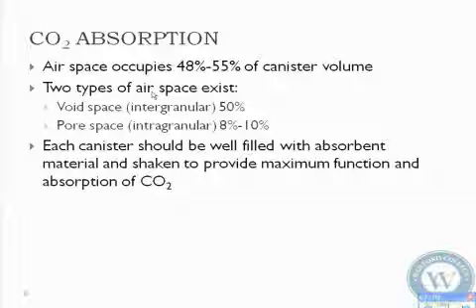So you never know for sure. If this thing is dry, it's not going to turn purple. It only turns purple when it reacts with CO2. Okay, if it's dry, you don't know. And then, anyway, we're setting our patients up to rebreathe CO2 at that point.